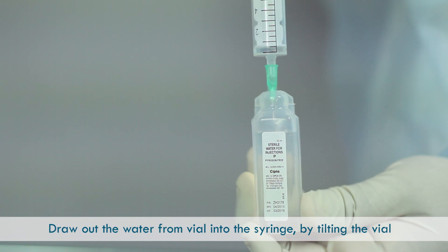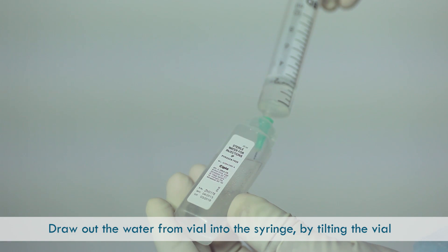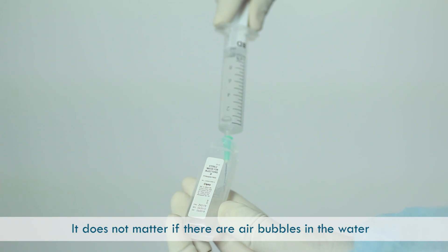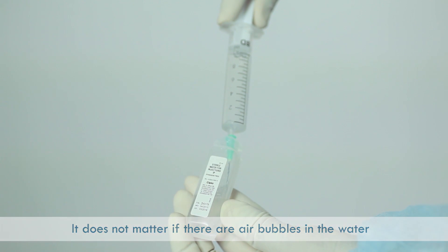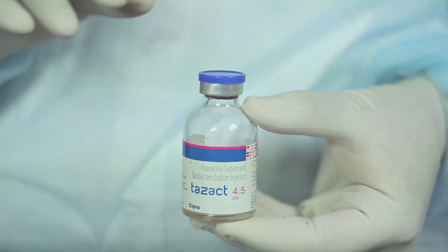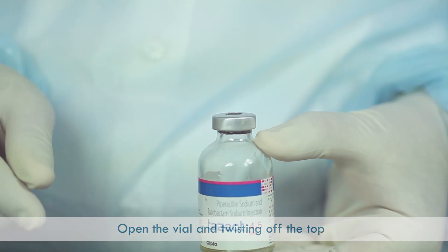Draw out the water from the vial into the syringe by tilting the vial. It does not matter if there are air bubbles in the water — just ensure complete withdrawal of water from the vial.